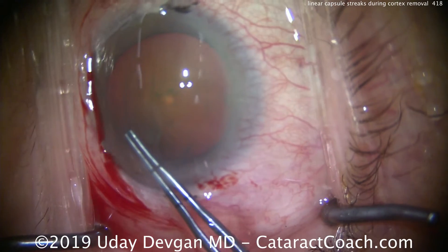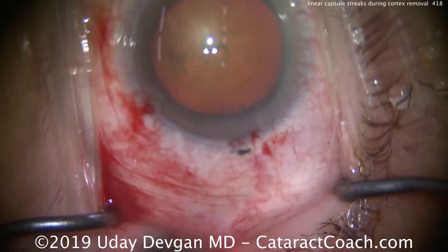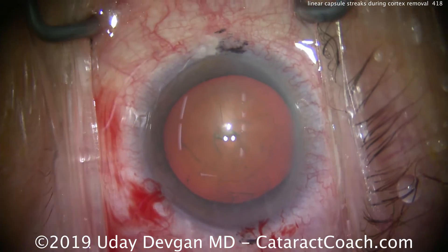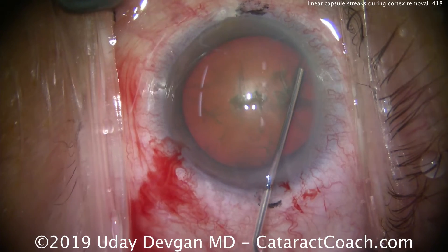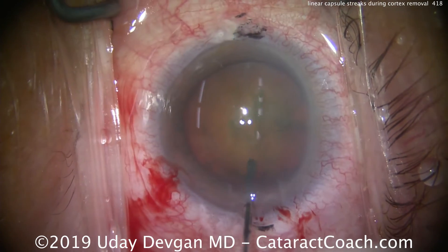This is a routine case on a patient who's more than 90 years old. We've made the main incision and side port, and we've made a nice round capsulorhexis which is well-centered in the visual axis. We'll do routine hydrodissection — watch carefully and let me know if you notice anything unusual. So far, so good. Nice round rhexis, and certainly it's a larger, dense nucleus.